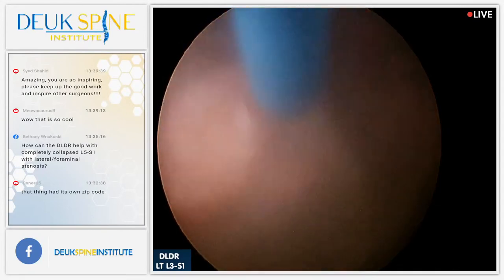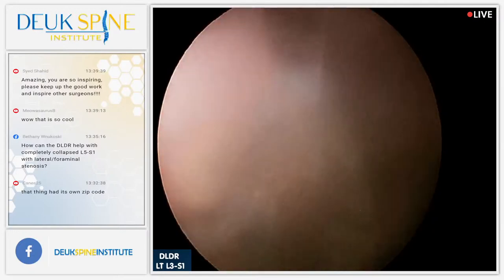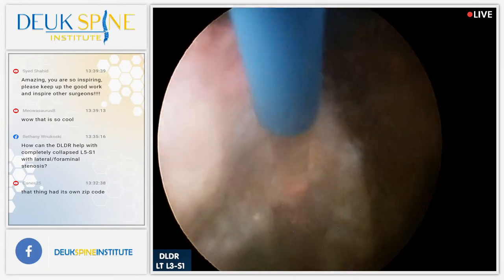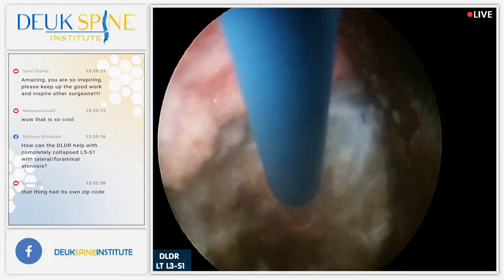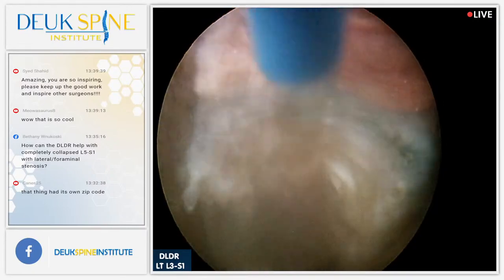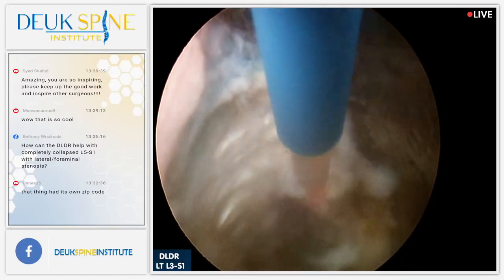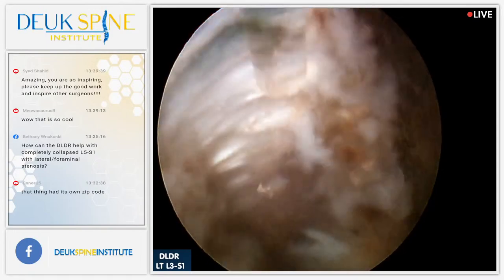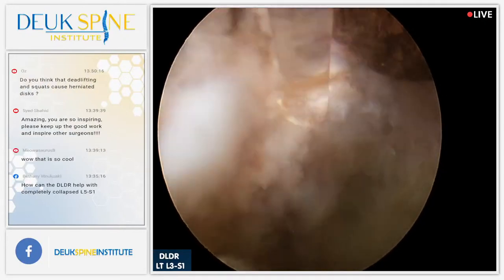A little bit of fat there. The nerve is going to be up there, the nerve root just outside that tube. Just about done, 30 seconds here and it should be done. A lot of fat at 12 o'clock, that's just epidural fat. Do you get that mask on, Bernadette? You get that thing on? By the way, take a look at the fibers there. I'll go back and show you.